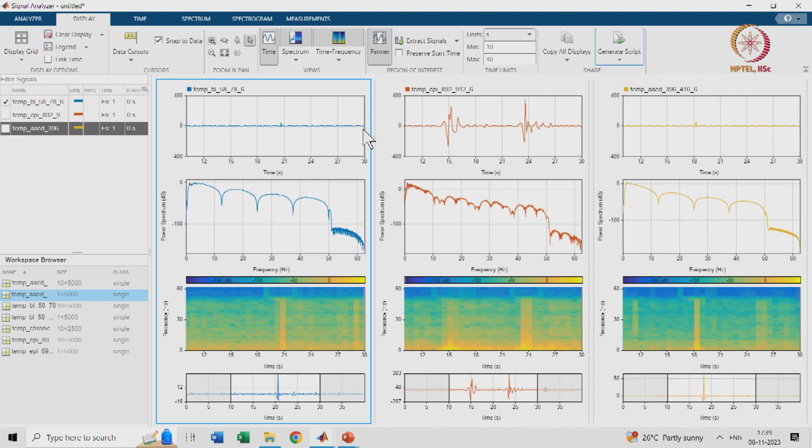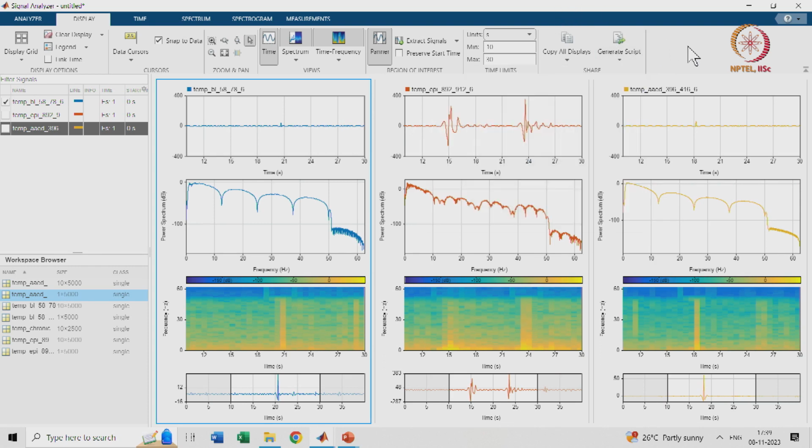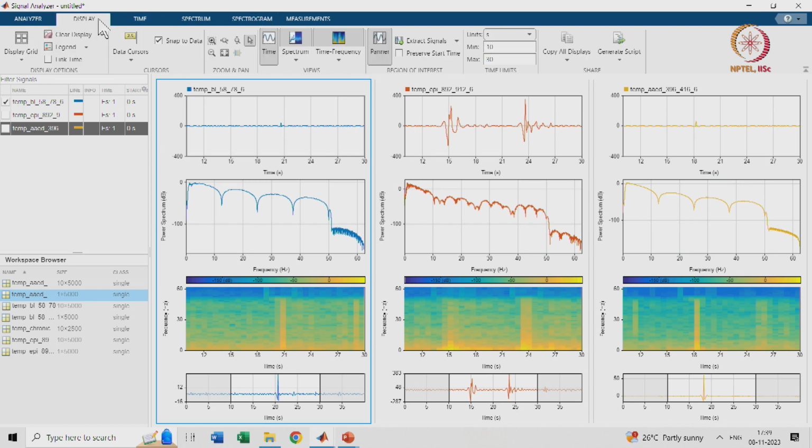So in the EEGLAB GUI, script was getting generated in the background, which you can use for a batch file. Similar thing here, this is a GUI where script is being generated, which you can use in the background. So more or less these are related things and very important and very basic for neural signal processing, and very easy to use. You can try. Also you can change this spectrogram too. You can explore this.